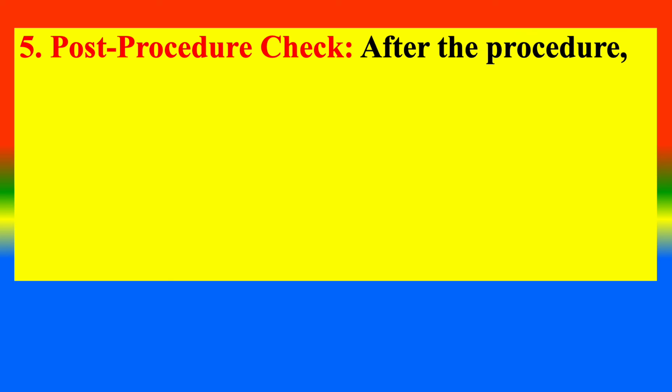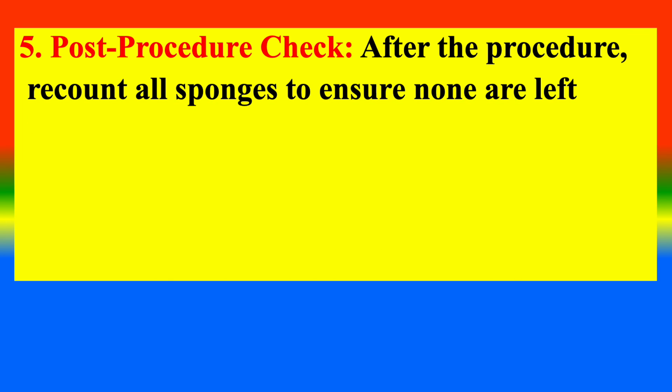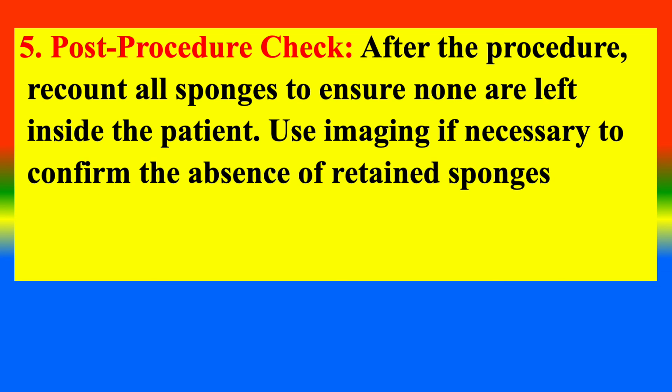5. Post-procedure check. After the procedure, recount all sponges to ensure none are left inside the patient. Use imaging if necessary to confirm the absence of retained sponges.